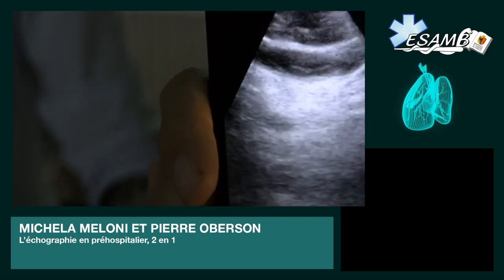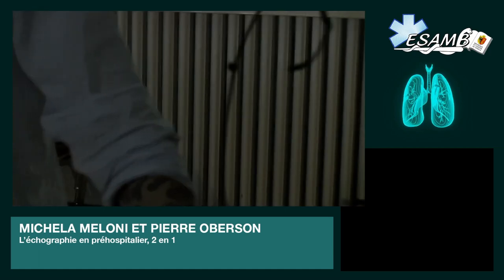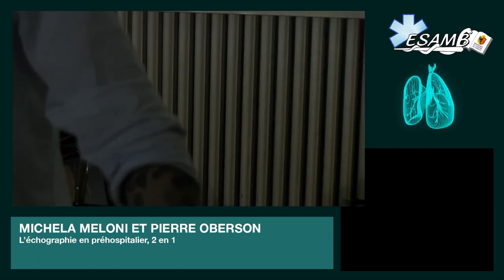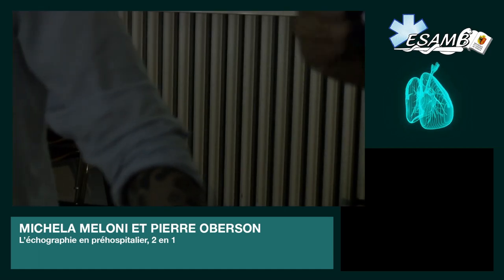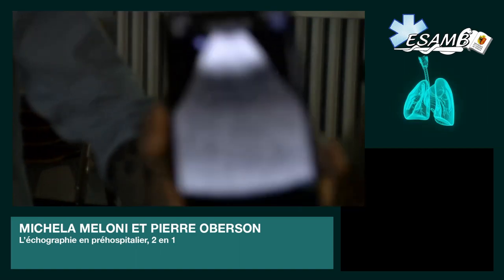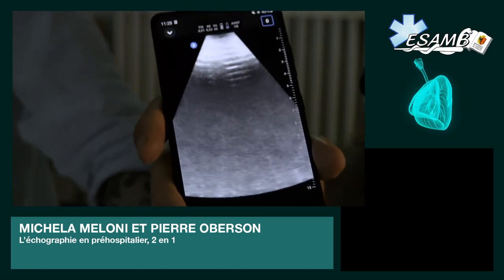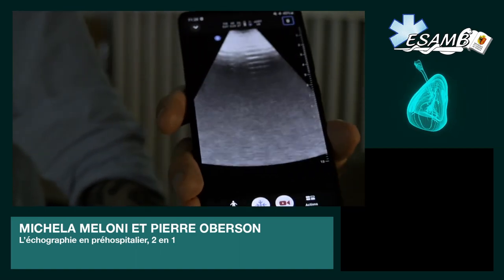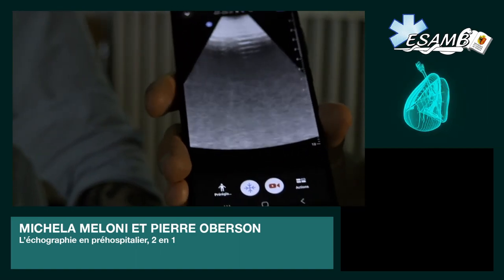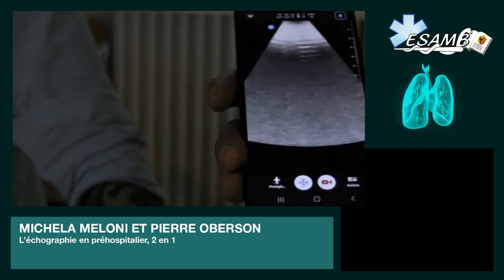Le but de cette démonstration, c'était de montrer qu'assez rapidement on peut quand même avoir une vue sur les organes vitaux du patient et donc prendre des décisions par rapport à ça. Évidemment, les protocoles sont un peu plus détaillés et précis que ça — c'est vraiment juste une démonstration rapide et simple pour la présentation.